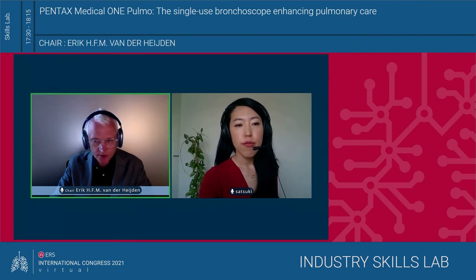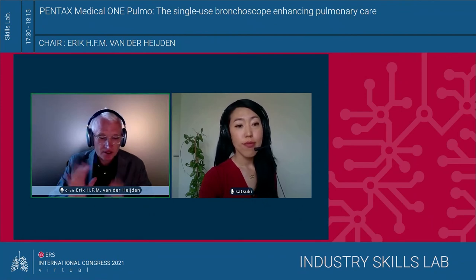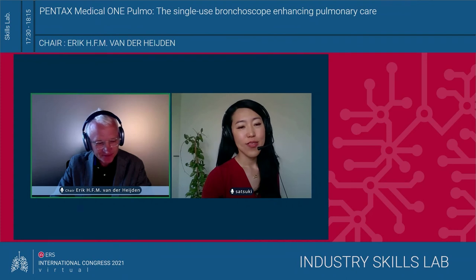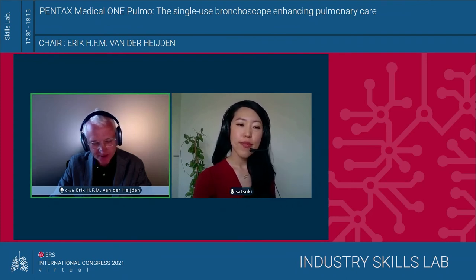More easily. But of course, if you're doing a bronchoalveolar lavage, then the suction really comes in handy, or if you're entering into a bleed. But luckily, I didn't have any major bleedings yet, so I hope to avoid using the scope for a major bleed. The big channel will help you there, but it's always better to avoid bleedings.